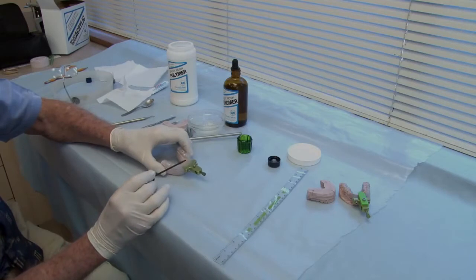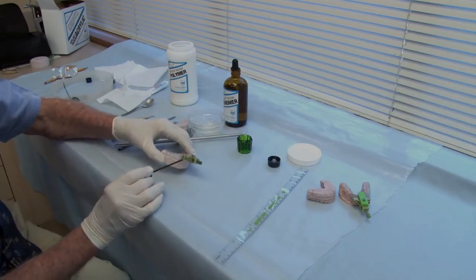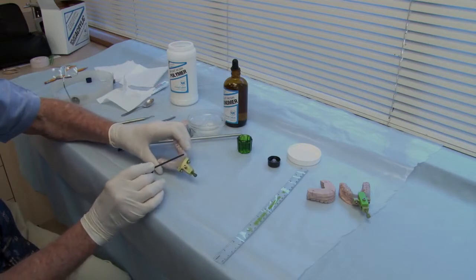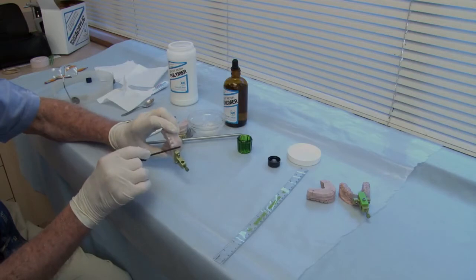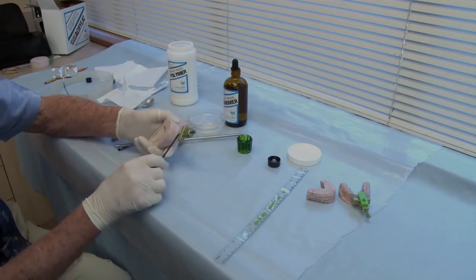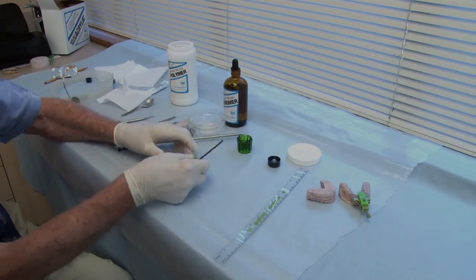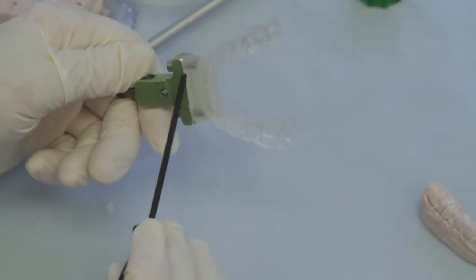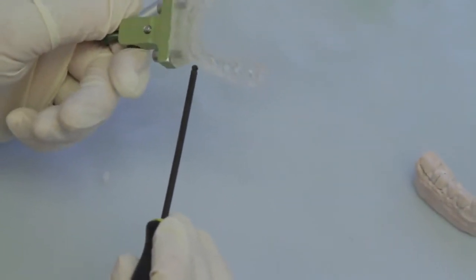You can see that the acrylic now blends in nicely with the biacryl base, and by using a burr and wet and dry sandpaper, you can get rid of the rough edges, round it over nice on the edges so that it's nice and smooth and comfortable to the patient. You want the patient to have a positive reaction. Now notice how it blends in very nicely, and that's our finished product.